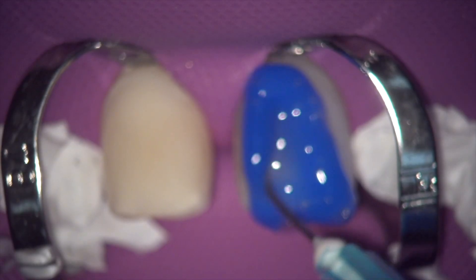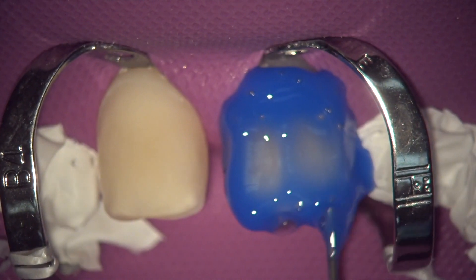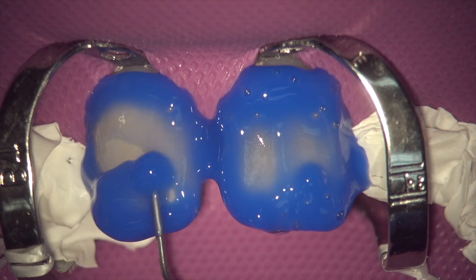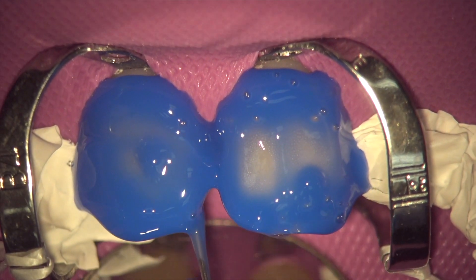Here's a trick you could use. Take the preparation surface, and if you're not sure if there's some composite here and you think there's enamel there, the best thing to do is just phosphoric acid etch it for 10 seconds, rinse it off, dry it, and the enamel is going to look different than the composite. The composite will not etch and get frosty looking like the enamel will.